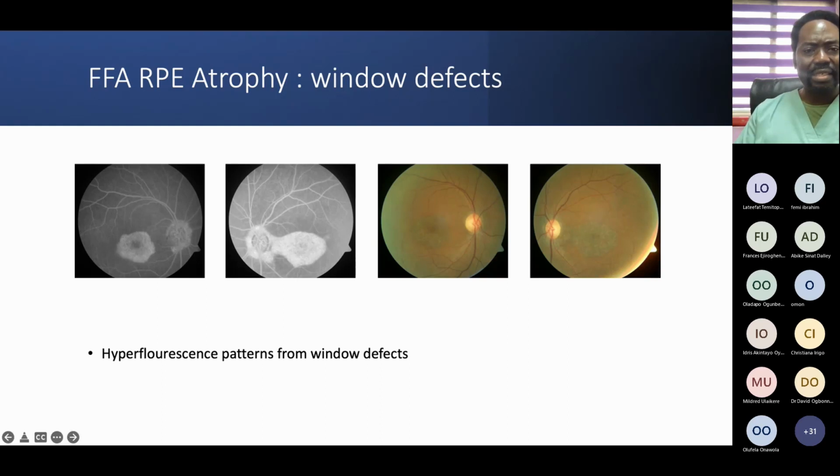So these are just the basic principles of fluorescein angiography and how to do your basic interpretation when you see an image. I always emphasize that with fluorescein angiography, we don't treat angiographic scans, we don't treat OCT scans, we treat patients. It's a good investigation, not standalone, but it gives us a lot of information and can help us in managing patients and in making more accurate diagnoses.